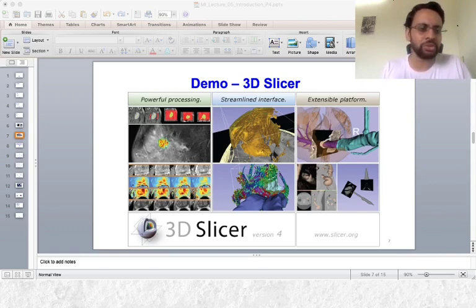Geometric transformations you would like to do. You want to resample your image, you want to analyze the image in the frequency domain, you want to extract the surfaces of it, you would like to perform registration. Registration has again different modules, for example the type of metrics you are going to use, and at what resolution you would like to do, what are the type of transformations you would like to use for performing the registration, type of interpolators, type of optimizers, lot of things.